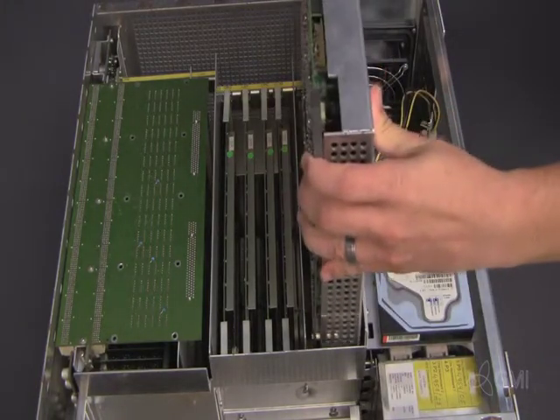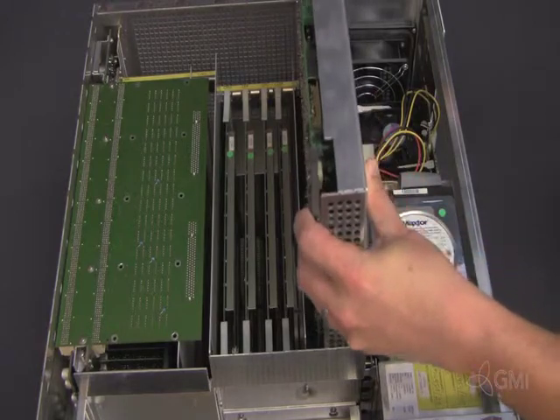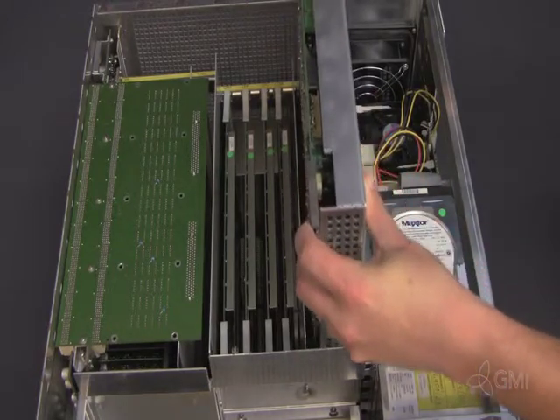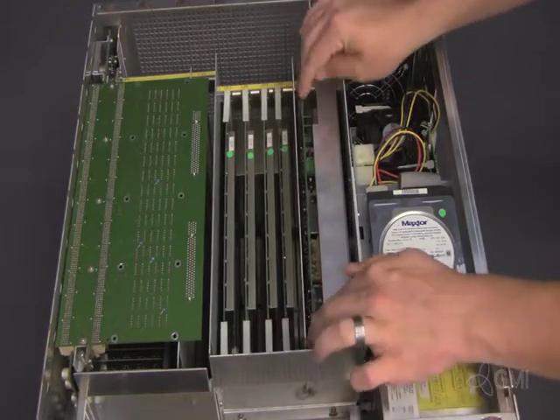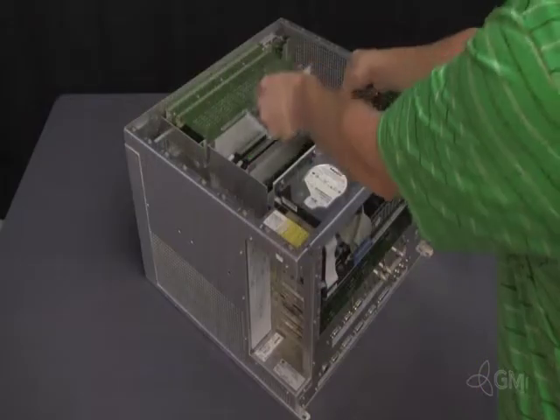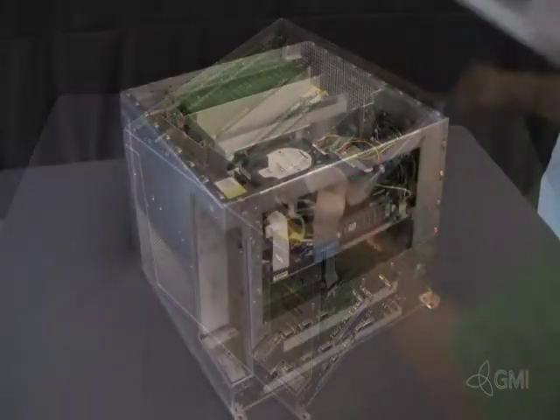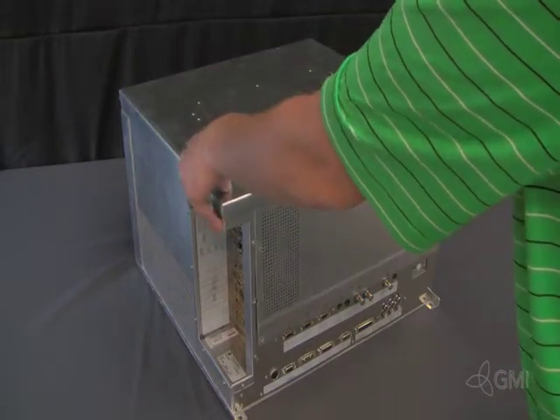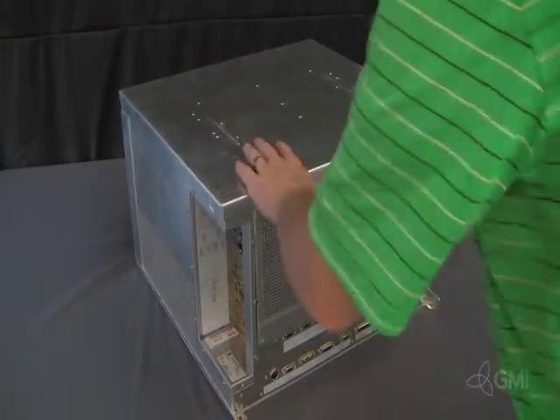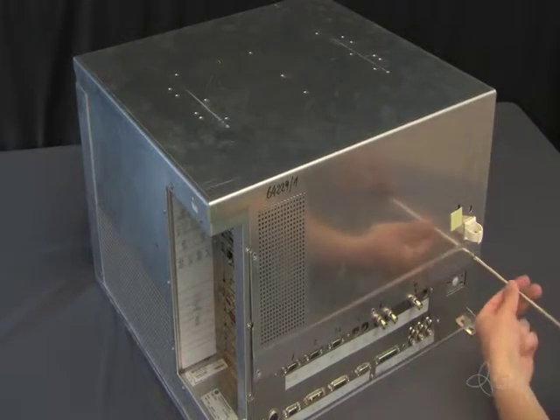Install the replacement CPP using the guide rails. Use the ejector tabs to lock the CPP in place. Reinstall the CPP cover. Replace the e-box cover and reinstall the 8 screws to secure the cover.